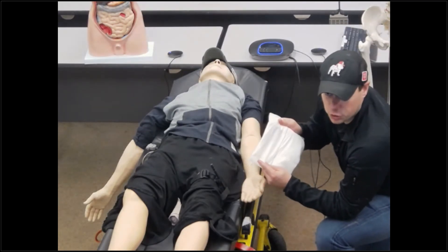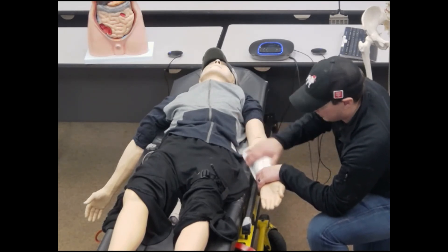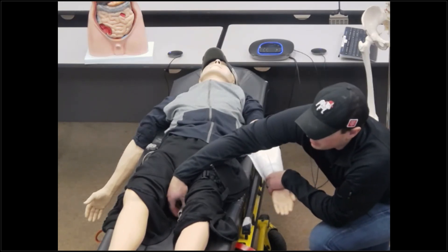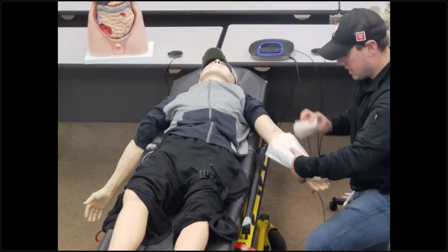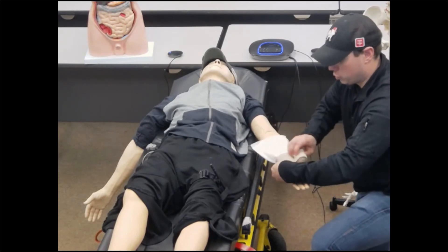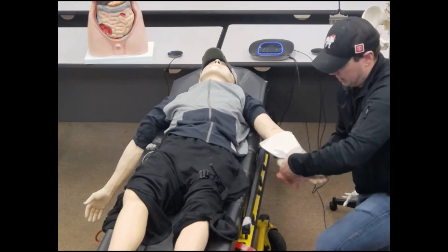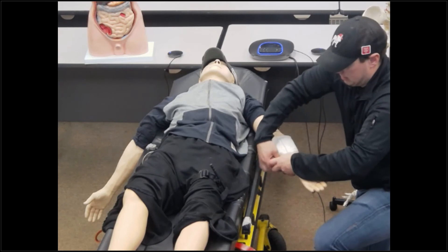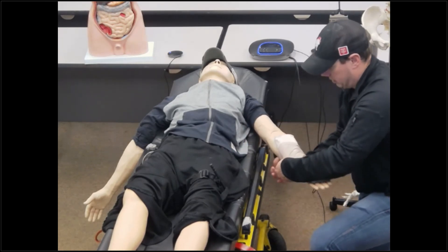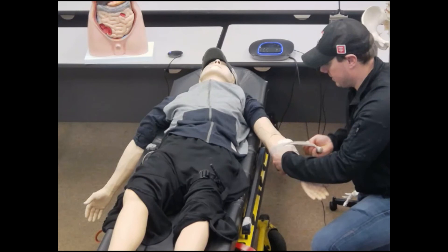I'm going to take my gauze dressings and place them up and down the patient's arm, entirely covering that bleed. I'm going to start applying direct pressure. Once I think I've got bleeding controlled, I'm going to take my ACE bandage and roll down twice. Now, every time I'm over that injury site, I'm going to twist. Those twists are directing all of the pressure on top of that wound, and it's also starting to tent the skin together.